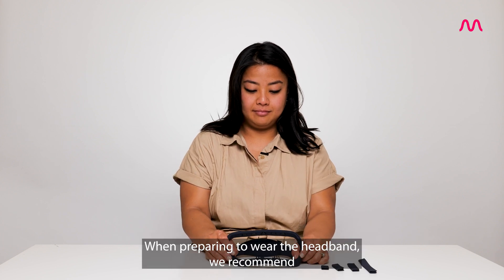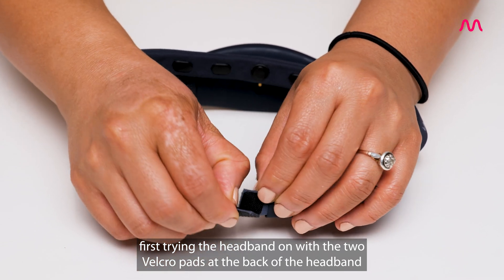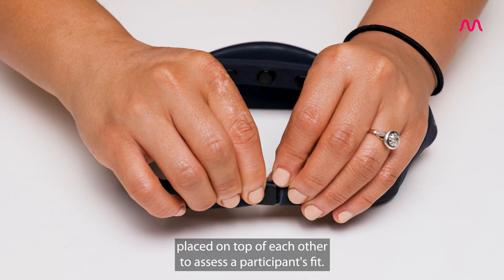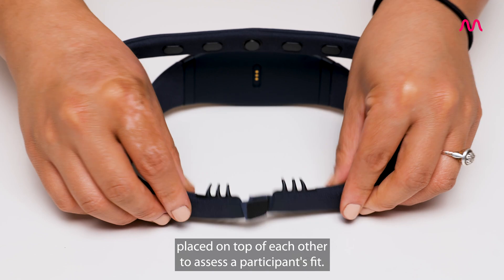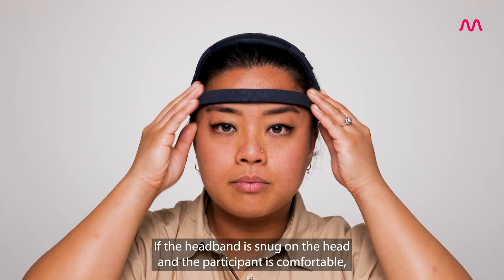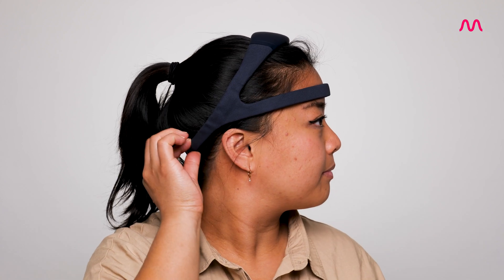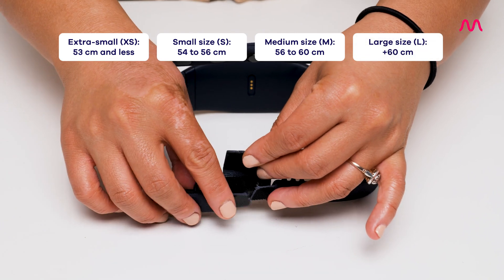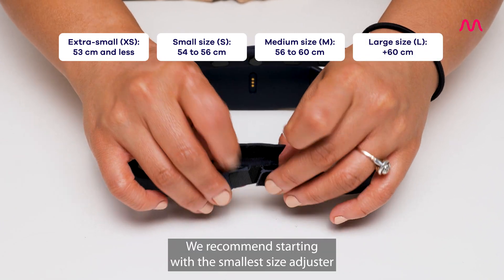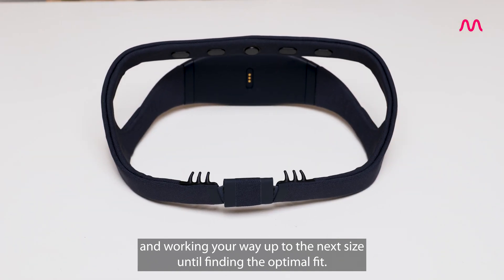When preparing to wear the headband, we recommend first trying the headband on with the two Velcro pads at the back placed on top of each other to assess a participant's fit. This is the smallest fit possible. If the headband is snug on the head and the participant is comfortable, the desired fit is achieved. If not, you can add a size adjuster. We recommend starting with the smallest size adjuster and working your way up until finding the optimal fit.